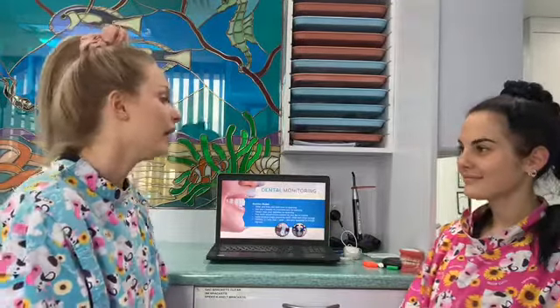And lastly, if you've got your aligners out and you're eating your breakfast or you've gone out for lunch, make sure that they always go into their little black case. So we never want to put our aligners down on a serviette or a tissue or anything, because waiters and waitresses aren't going to know, they're just going to pick them up and throw them in a bin. So just making sure they're always kept in your little black container.